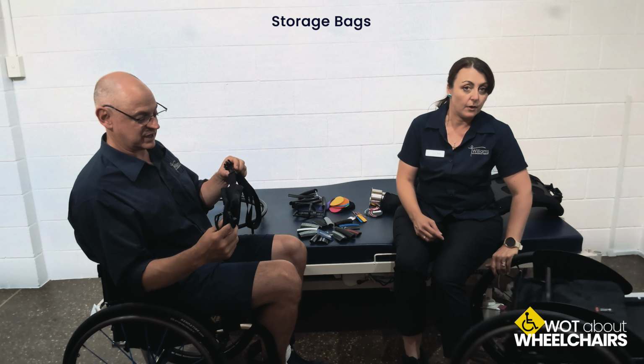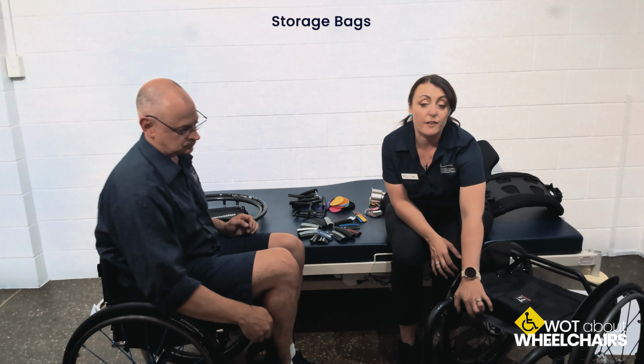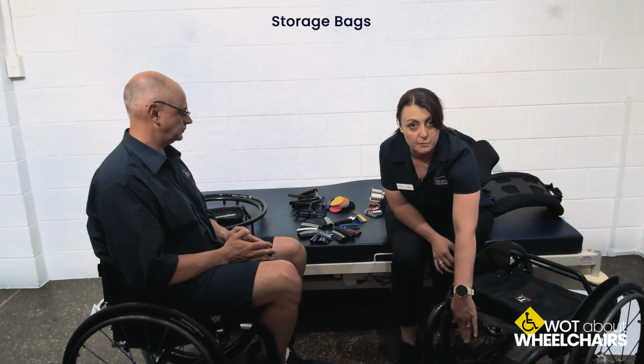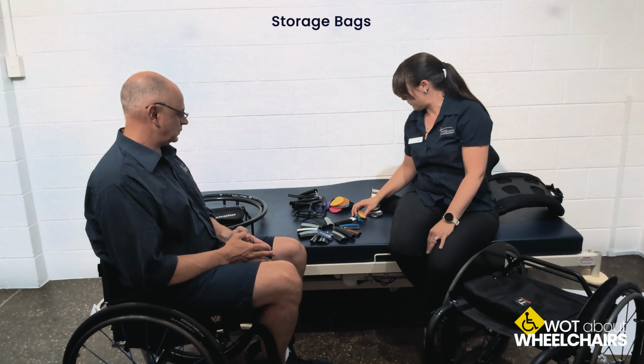Some of the chairs will actually have a mobile phone flap that sits just here, and you can actually stick your mobile into it as well, which is really useful and very practical, obviously.